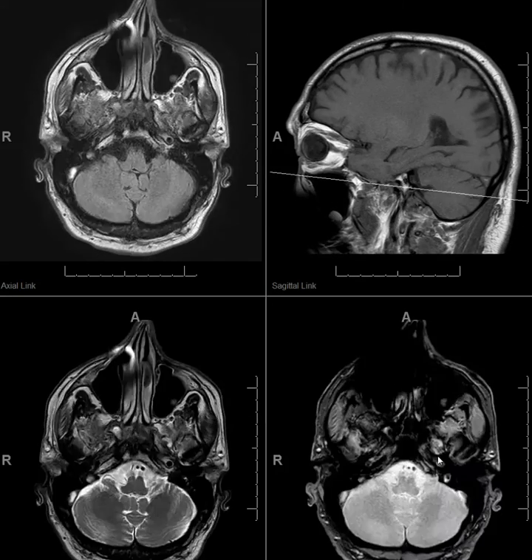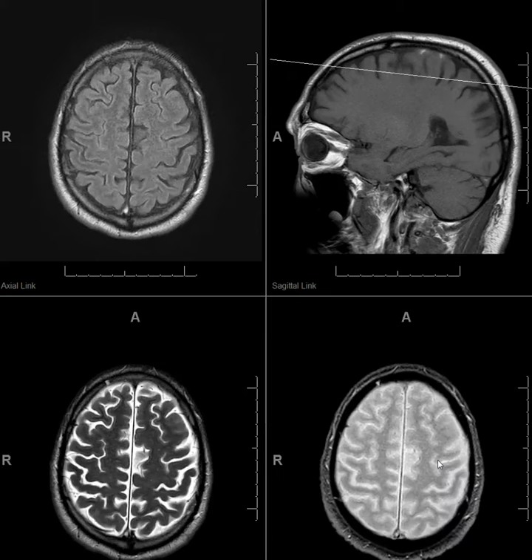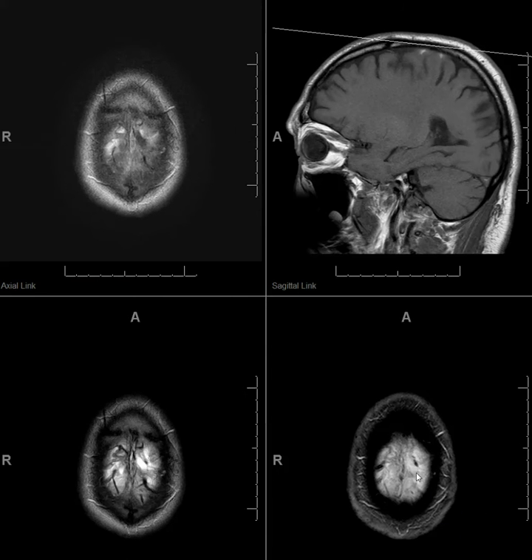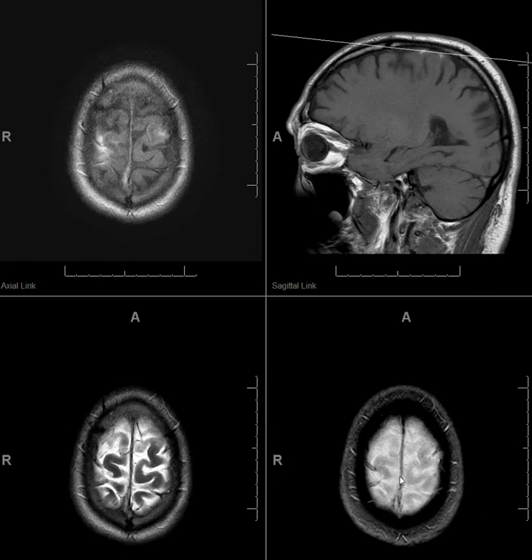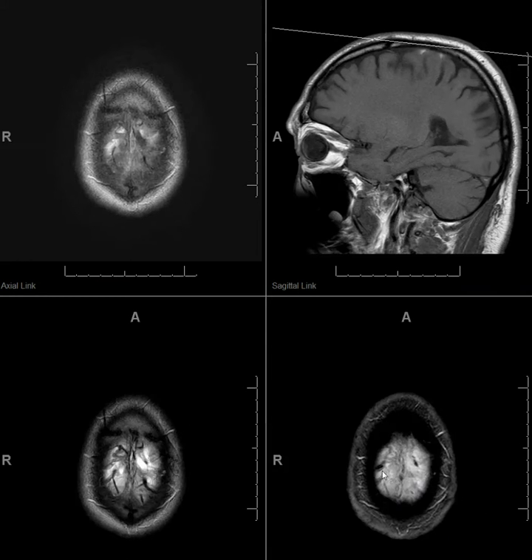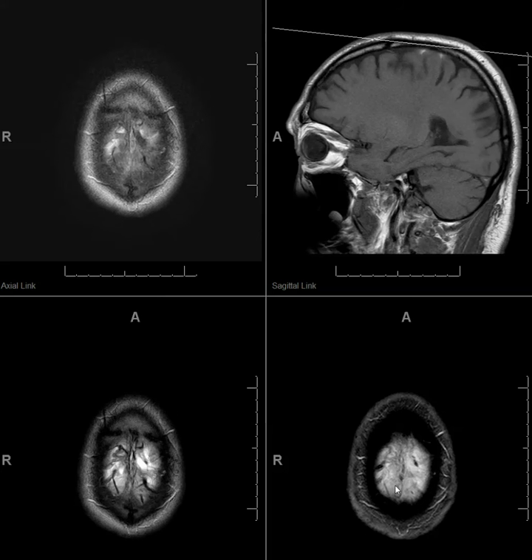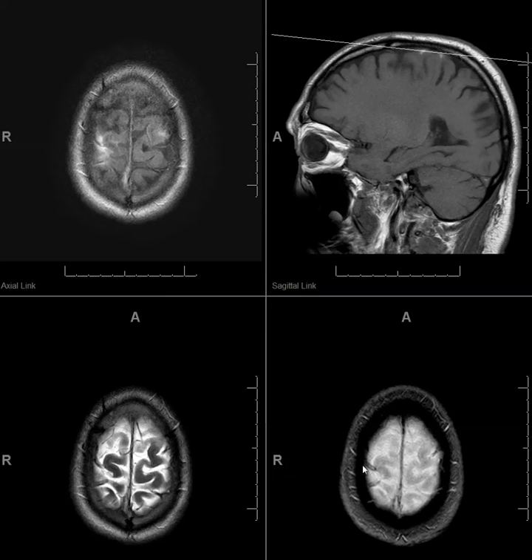You can see it better on the gradient echo images — the so-called cord sign, which is right here. The lining on the surface — the black lining you see — represents hemosiderin deposition. They are the clot.